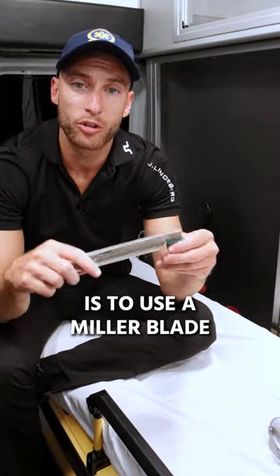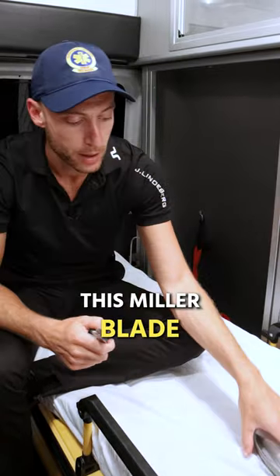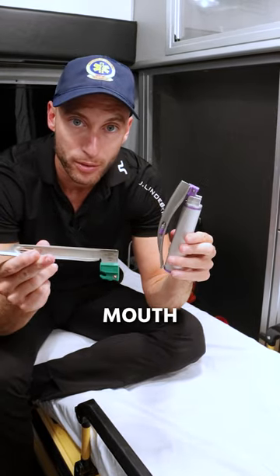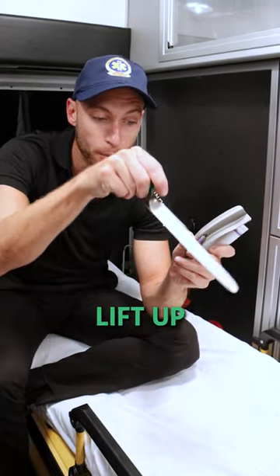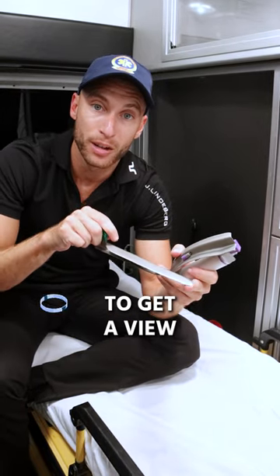The other option is to use a Miller blade. The difference between this Miller blade and this MAC blade is where we place it in the patient's mouth. This is going to go to the vallecula, while this end is literally going to lift up forward and upward, lift up the epiglottis to get a view.